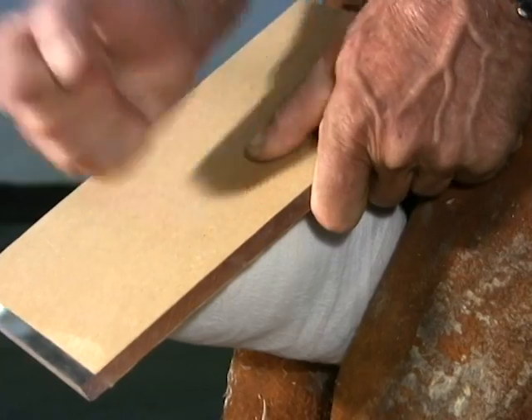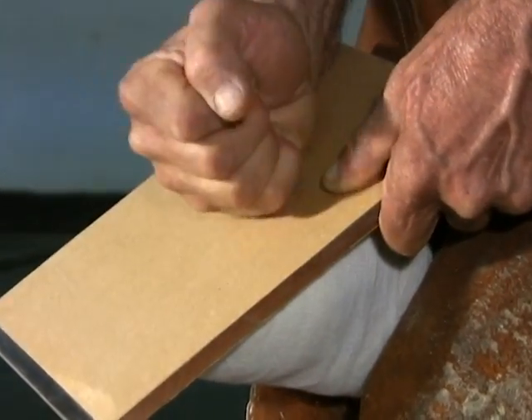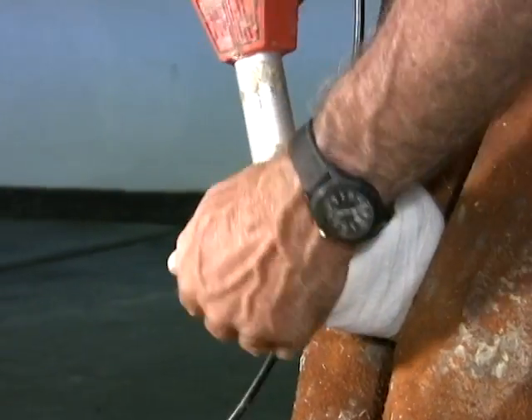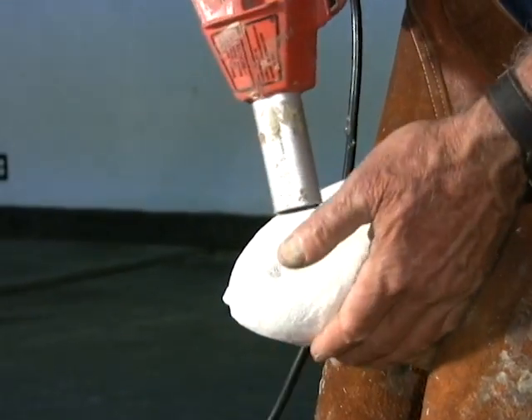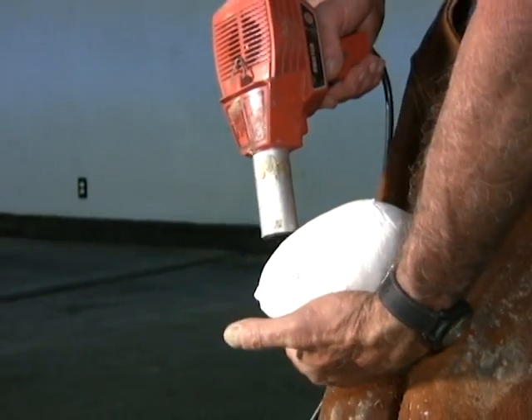Use a flat surface to flatten the bottom of the mold while it's still soft. This prevents mold sag when the positive is poured. You can use a heat gun to speed up set time, especially in cold weather, but it's important to keep your hand by the foot to ensure you're not overheating the mold.